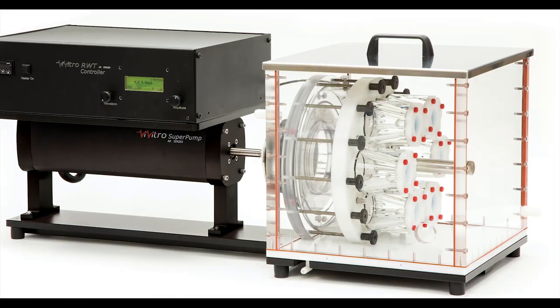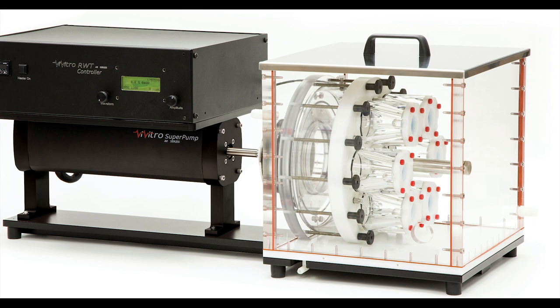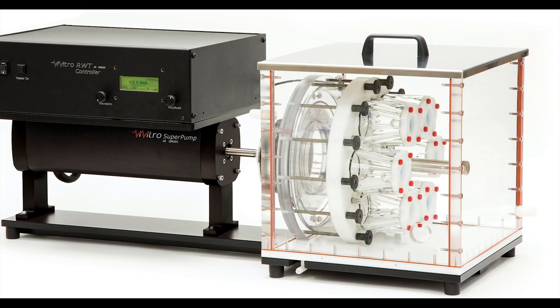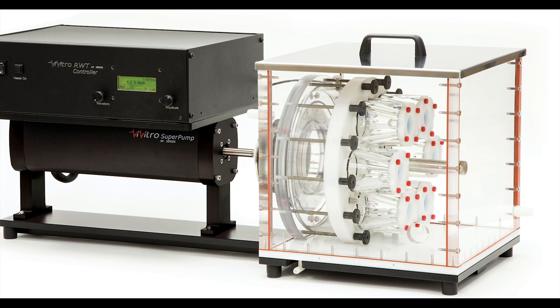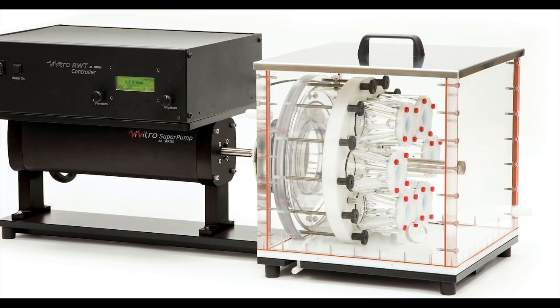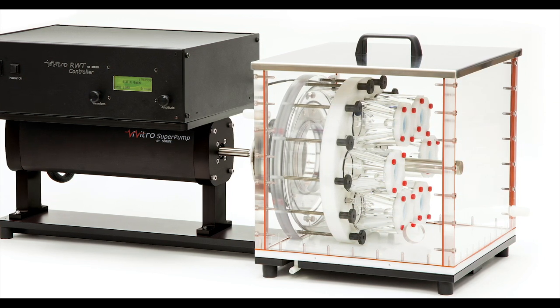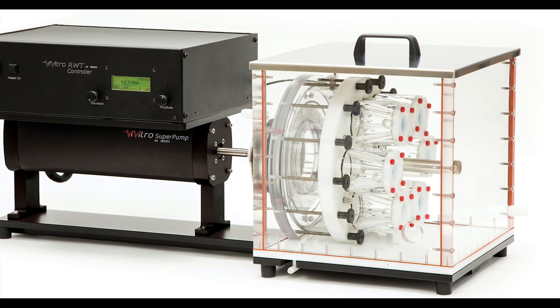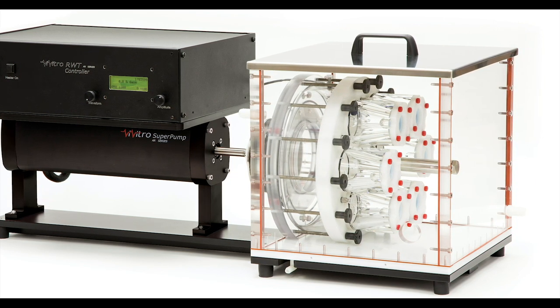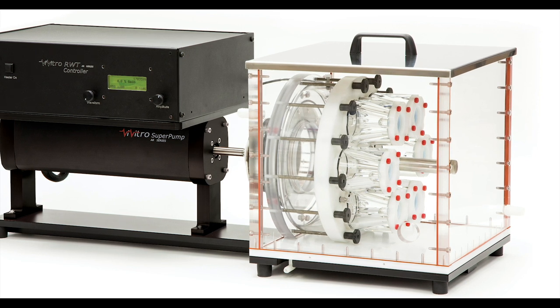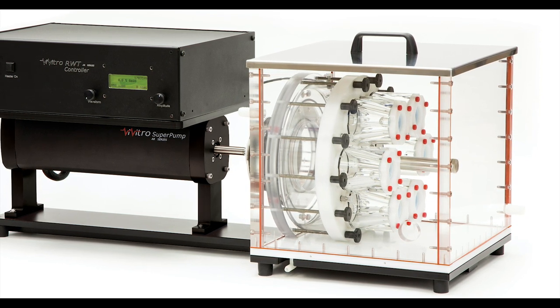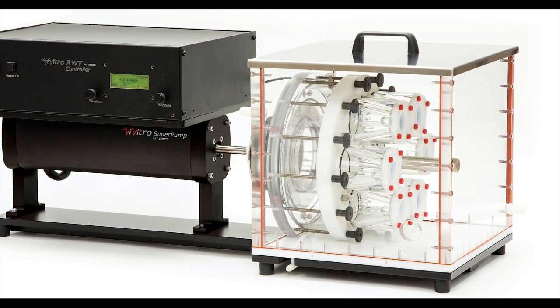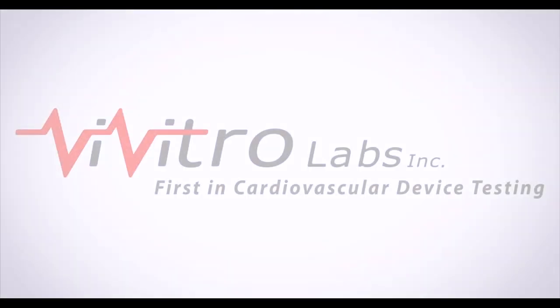The super pump is also the core of the real-time wear tester or RWT, a quasi-real-time wear tester for heart valve replacements, venous valve replacements, occluder devices, and other cardiovascular devices. It can be customized for devices and device mounting arrangements, including conduit mounted valves and large prosthetic heart valves. A change in controller firmware and mounting components adapts the super pump to the real-time wear tester system configuration.